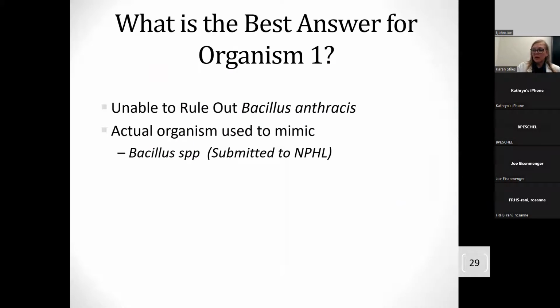Okay. So unable to rule out Bacillus anthracis should be the answer. If you felt otherwise, please let me know. We'll walk through it. The actual organism, unfortunately, I did not speciate. We just know it as a Bacillus species.